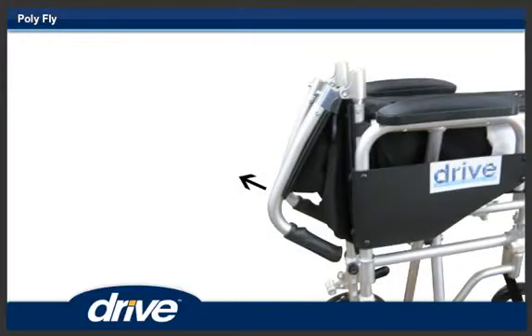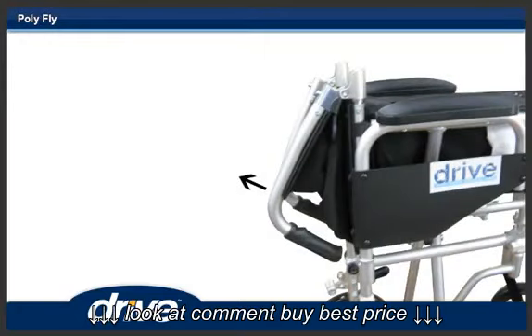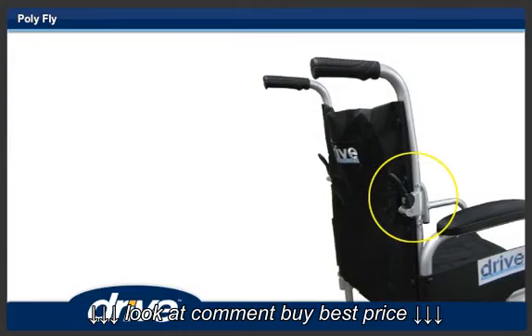Step 1. To unfold the back, lift up on both push handles until the back locks into place.